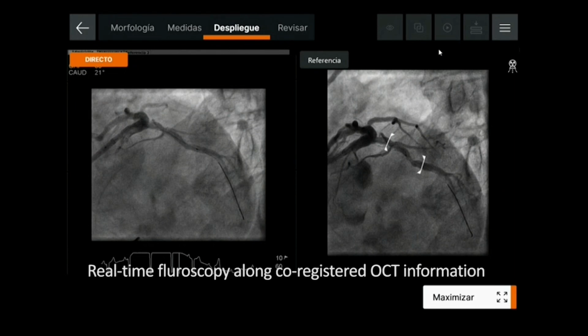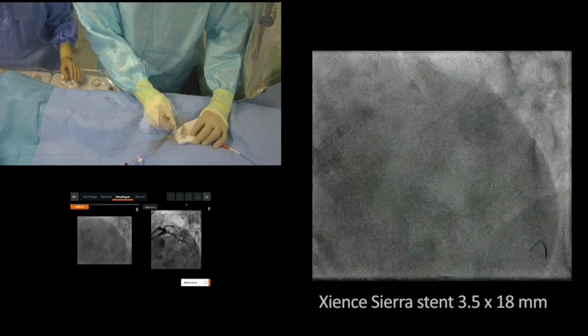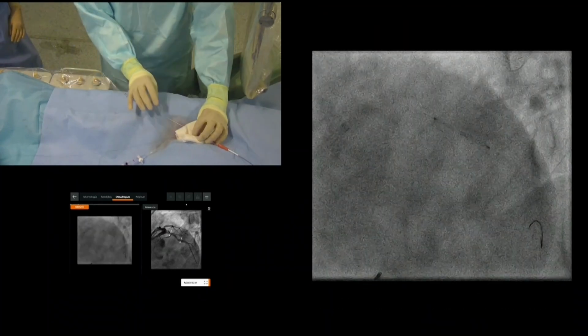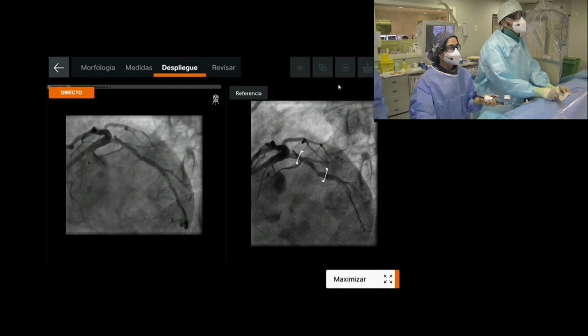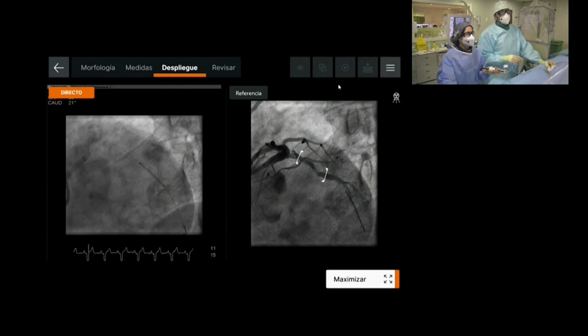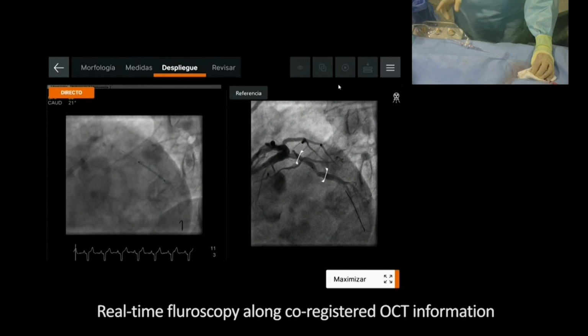So this is this new feature Javier was talking about that is very useful for stent implantation. You can see on the right panel the region that you have selected for treatment with the references. And on the left panel, you can see your live angio, so you can really guide your procedure knowing exactly where your references are. Our colleagues will be interested because we can see in real fluoroscopy. Can you give me some injection here? And we can make sure that we really mimic the location that we have identified in the co-registration with OCT, which I think basically will be something like this. Do you agree? Well, let's check it again if you wish.